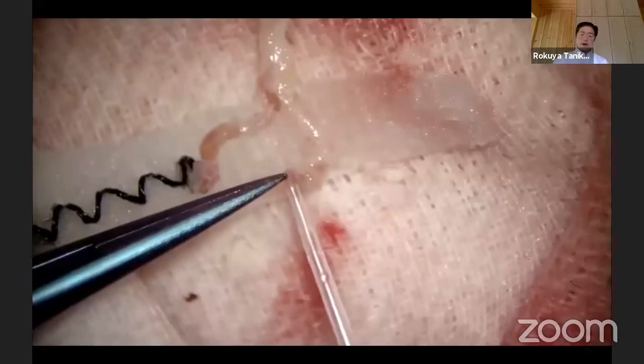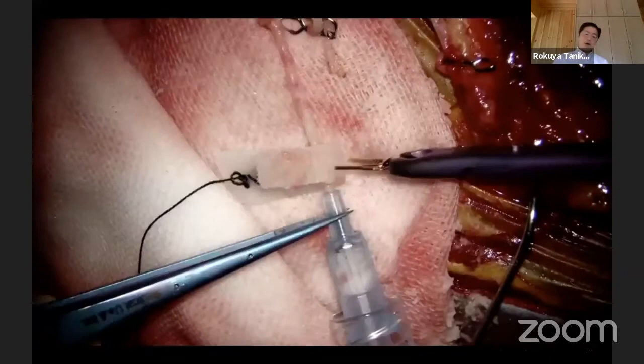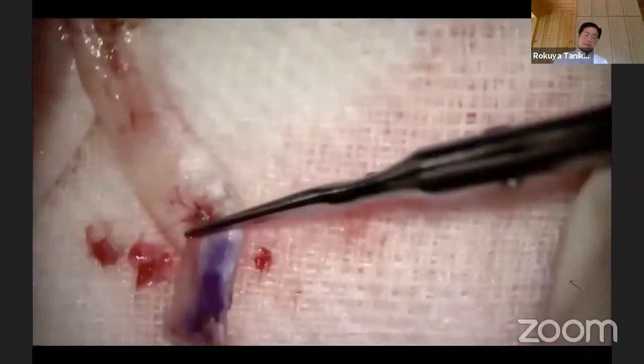Another remaining branch of the STA is cannulated with a 22-gauge cannula connecting to blood pressure monitoring.